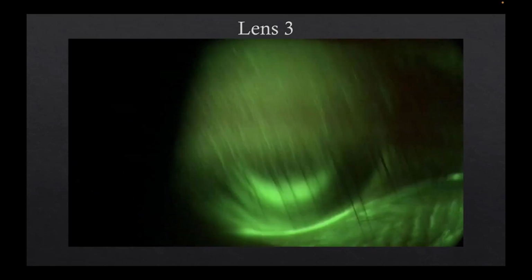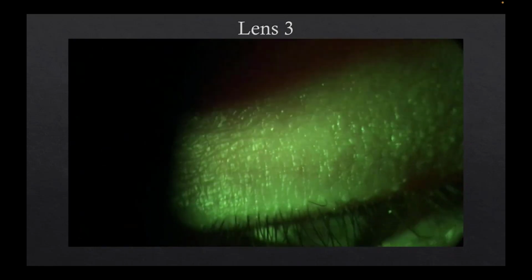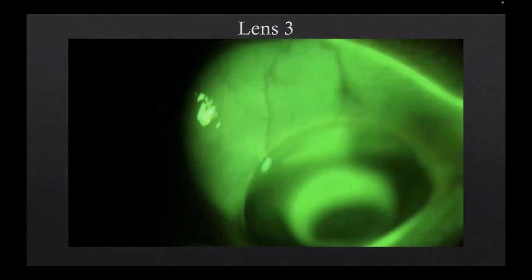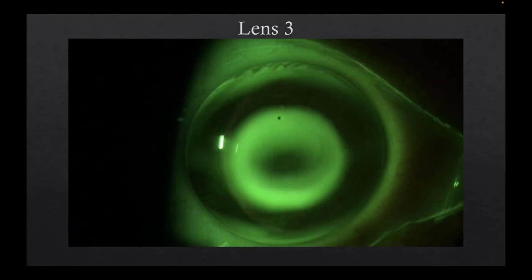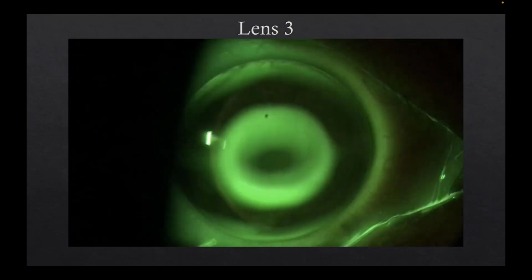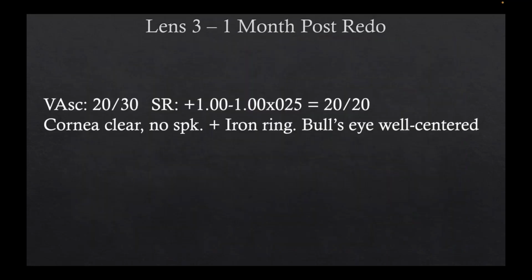And so here's what that lens looks like. You can see it looks like I'm bleeding into that lower alignment curve area, but I think there was just a little too much fluorescein and flooding, because once I pulled the lids off, the alignment curve really did tighten up. You can actually appreciate the oval treatment zone on that video. But alas, I told you I should have left it alone at lens 2, but I didn't. And you all should learn from my mistakes.